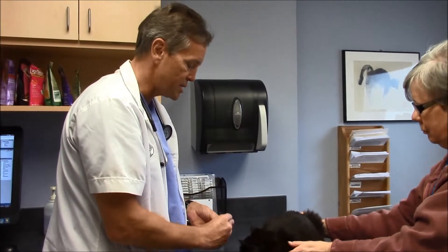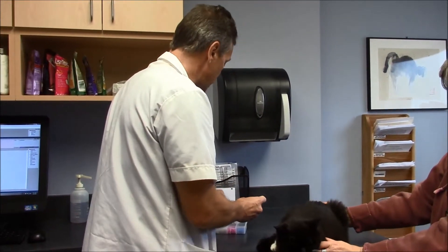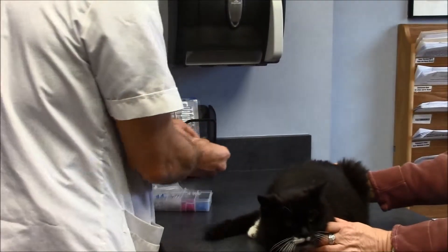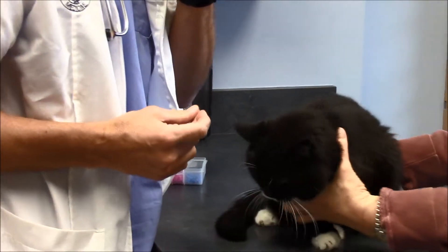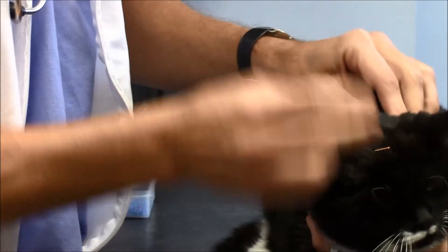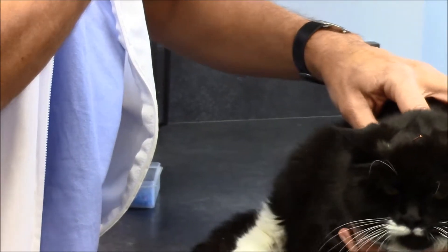Each of the acupuncture points has a different meaning or different reason why we use it. The first one I'm going to put in is governing vessel number 20, and it's in the top of the head — it's a relaxing point. I'm going to go down her back and put some other points in here.